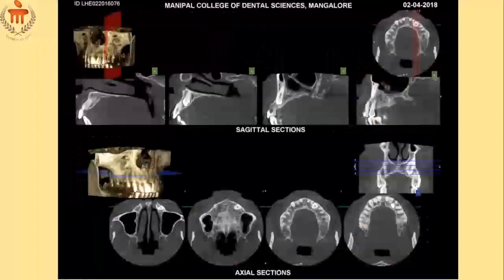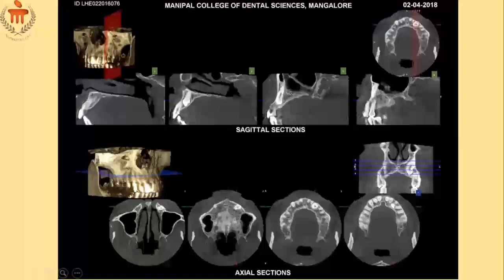Similarly, for the same patient, I'm giving you an axial section now with 4 sections, each of them marked really well. Can you see those lines there? 1, 2, 3, 4. So you know this is the sagittal plane, and this is the axial plane in 4 levels. That's how you start to interpret. You look at what level the section was taken, and then you get an understanding of what you are seeing.